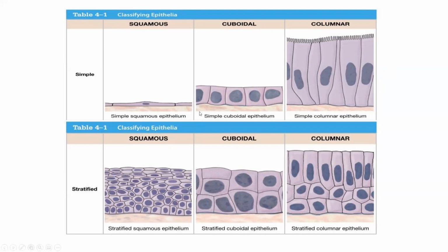cells. If the cells have a square-like appearance, like this right here, and this right here, we refer to this as cuboidal, and the best way I remember this is to remember that one side of anything cuboidal will have 4 seemingly equal sides.